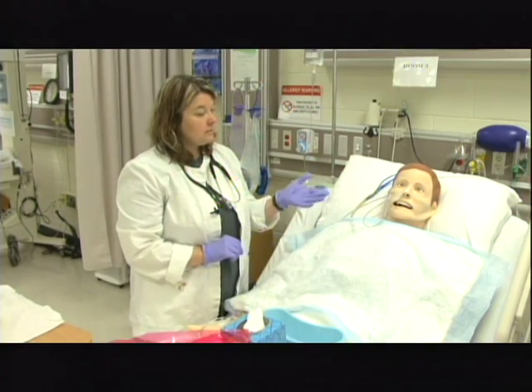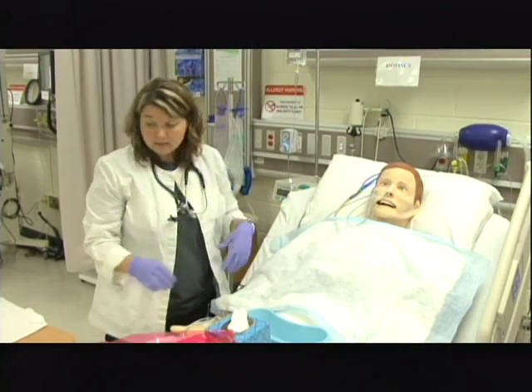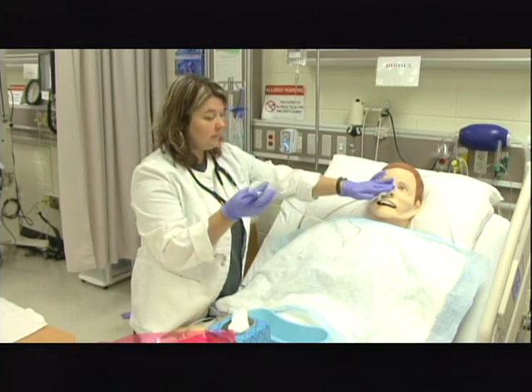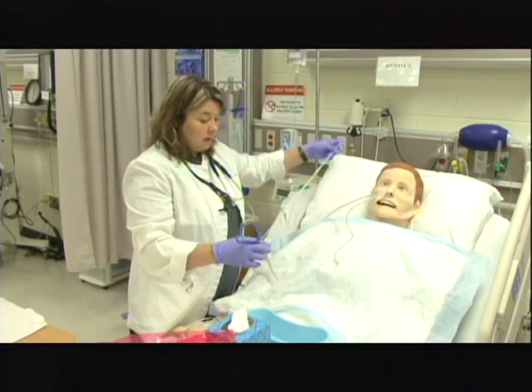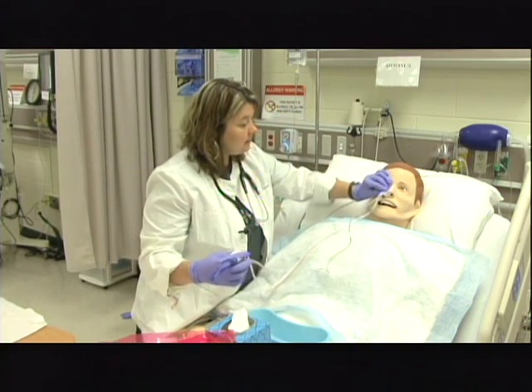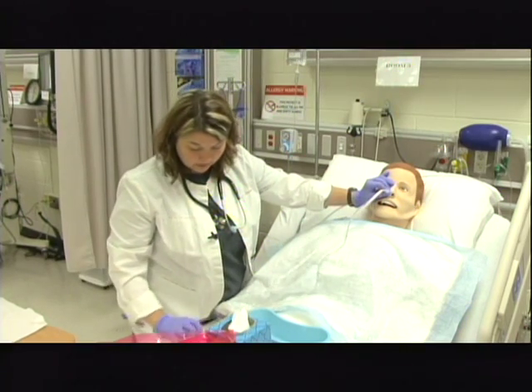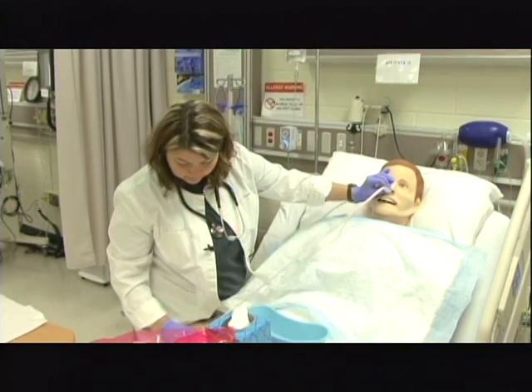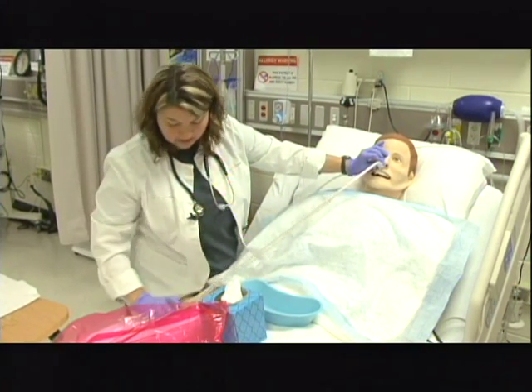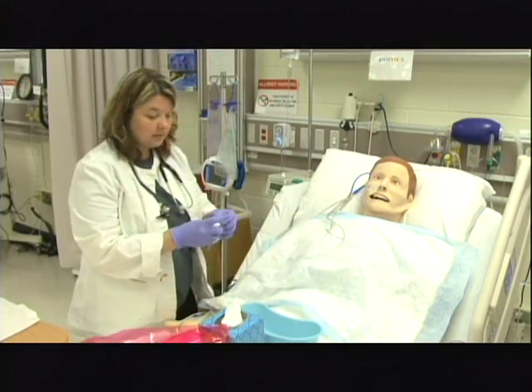The first thing I need to do again is establish placement. So the first thing I'm going to do is come over, and I like to measure first. So again, without pulling on the patient's tube, I'm going to measure from the entry at the patient's naris for the tube, and I'm going to lengthen the tube out here until the very end and measure to the end of the clear plastic. And again, it is to the 79.5 that I had pre-measured. I'm going to move this back up above the patient's level of the stomach.